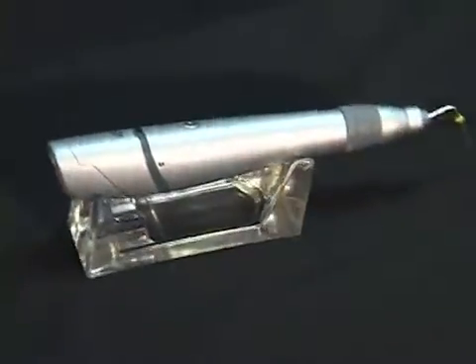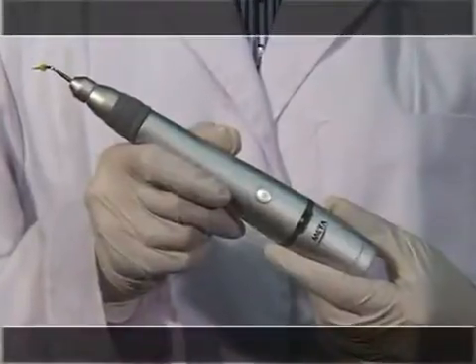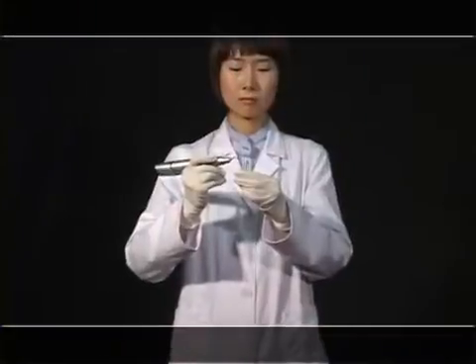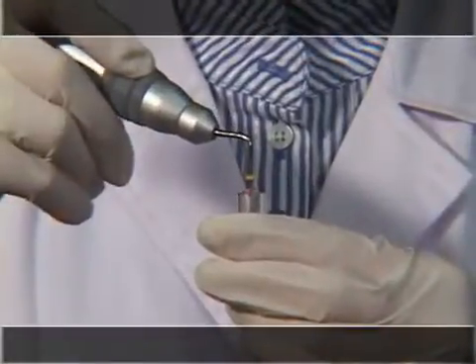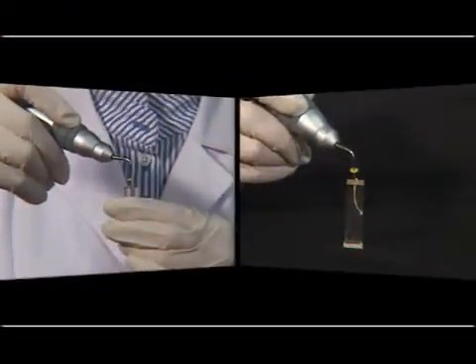We will provide you notes about the Master Pen for effective use of this product. The pen tip is designed to heat the apical point and to fill the root canal elaborately with Gutta-Percha, melted by the heat apical point, which was inserted into the root canal inside the tube.